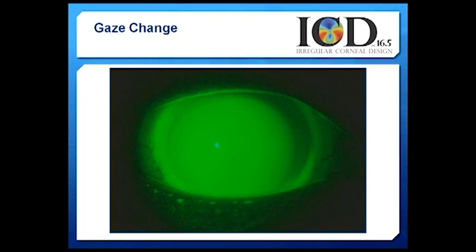Now, this is another example where you see a lens with bearing throughout the nasal aspect and possibly into the superior cornea. That bearing appears more arcuate to a small area from maybe 12 o'clock, maybe 11 o'clock around to 3 o'clock or 4 o'clock. So less than 180 degrees of bearing. But if we're not sure, we'll ask the patient to look down and out.